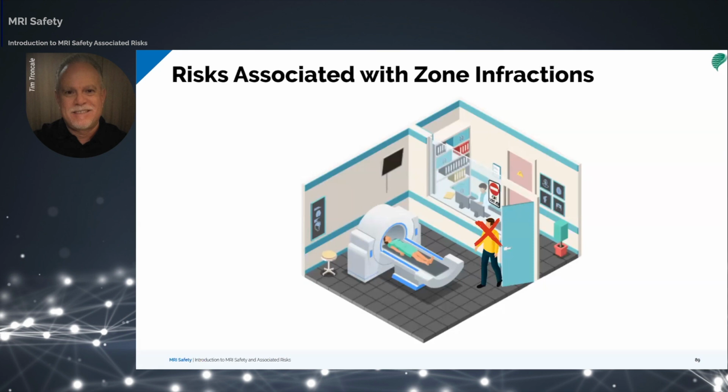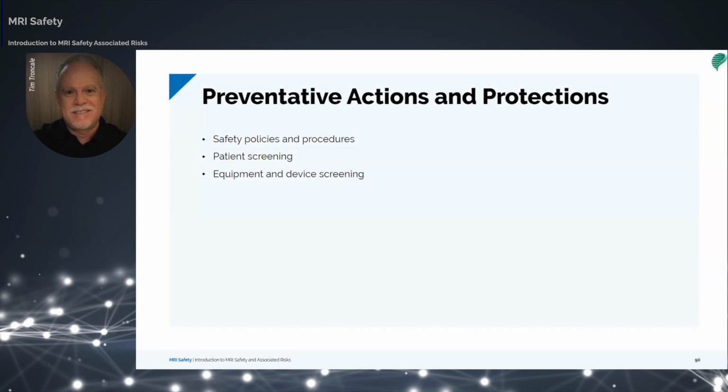This means all healthcare workers, maintenance personnel, physicians, any family members or friends accompanying the patient. Because if this person is not screened and he runs in, he may have objects in his pocket. He may even have something inside his body like a pacemaker.